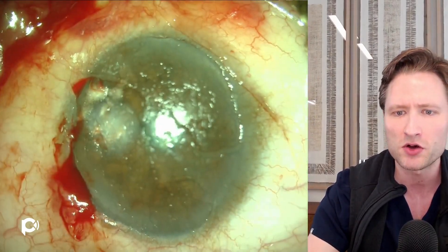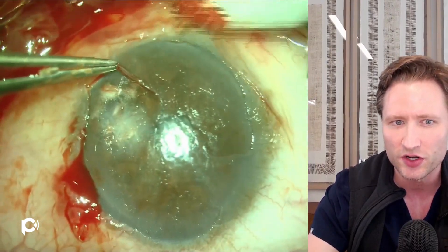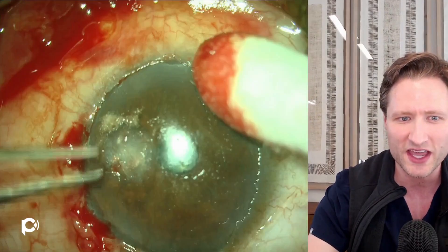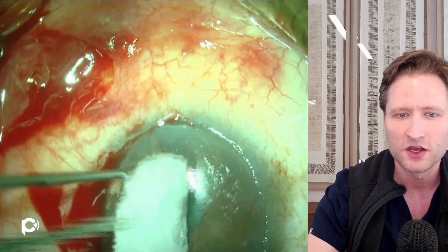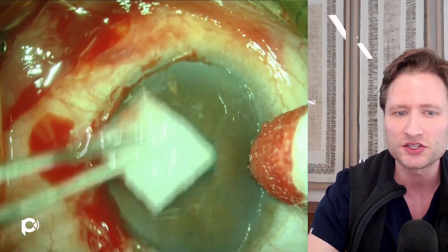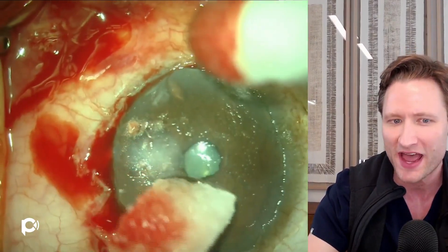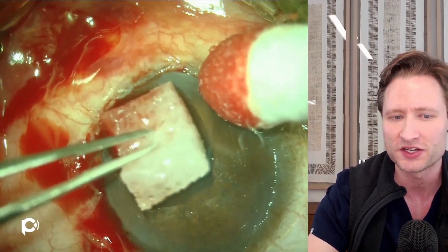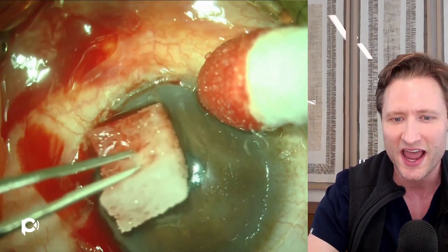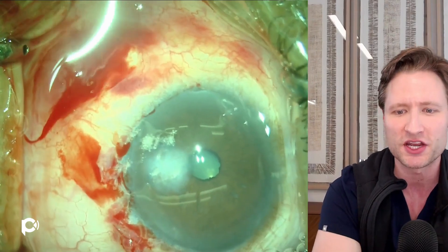That is the first component of addressing this eye, because interstitial keratitis can result in anterior scarring as well as endothelial decompensation. Once we have the anterior surface cleaned up, we apply a mitomycin-soaked sponge just to minimize a reactive scar or haze that would form in the aftermath of this operation. I hold it against the surface of the eye for maybe 10 to 15 seconds to suppress haze formation, then irrigate and proceed with the DMEK operation.